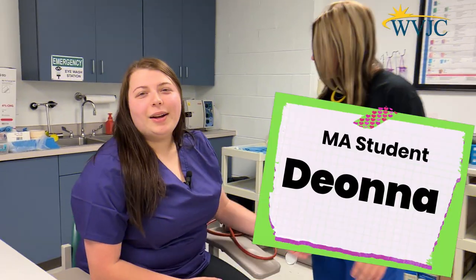Hi, my name is Maddie. We're here today at West Virginia Junior College. We're in the medical assistant program and we're going to show you how to take blood pressure. I'm Deonna and I'm going to walk you through as she takes my blood pressure.